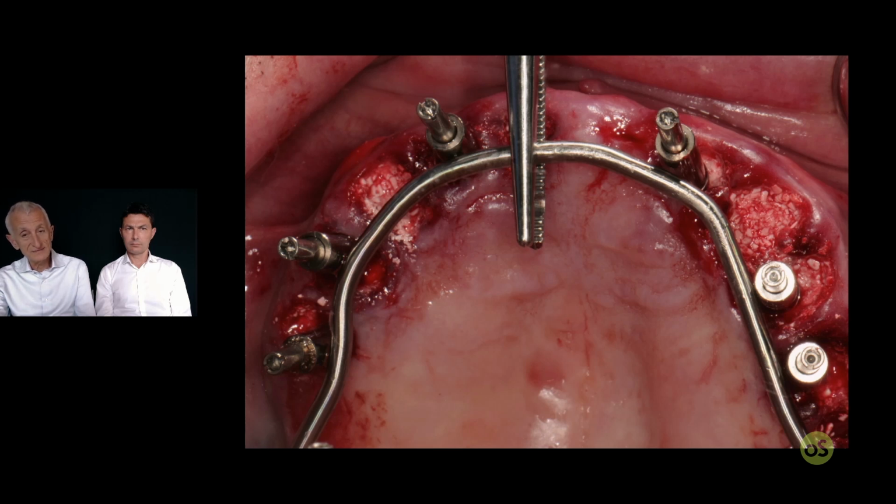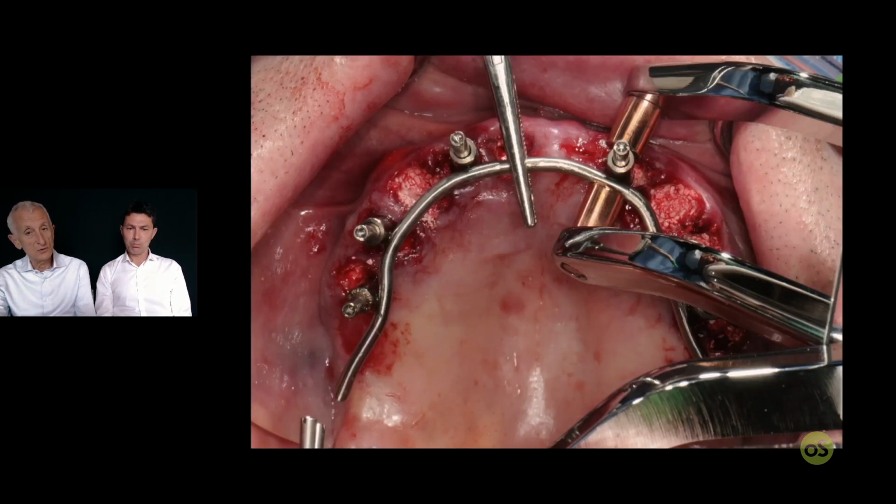With one hand, here replaced by a hemostat to avoid having the hand in front of the lens. Okay, so with one hand you hold the wire, with the second hand you hold the clamp, and you put the clamp as I told you in lesson number 3, at 90 degrees perpendicular to the wire, where the most important electrode is the one against the wire that has to be parallel.